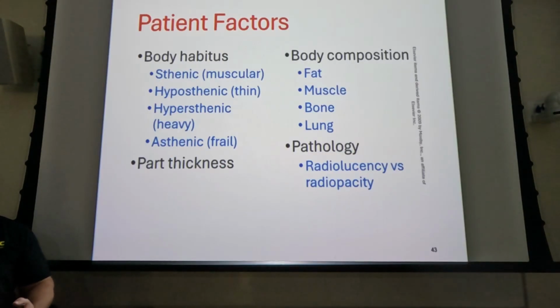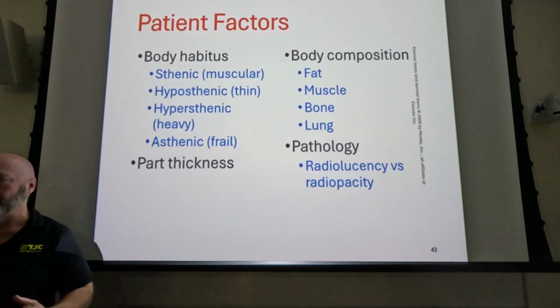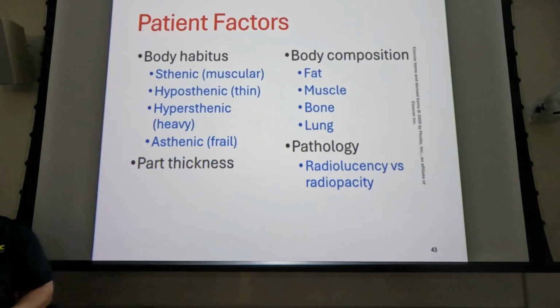Now, if you have an additive or destructive disease that added or removed bony tissue, now you've got something different. If you've got a patient with osteopetrosis, Paget's disease, acromegaly, something that added a lot of bony tissue, you might want to increase your KVP in that case, okay? And if you're looking at a 30% increase in mass, that's roughly 1/3 of a doubling. Well, how much KVP does it take to double image receptor exposure? 15%.